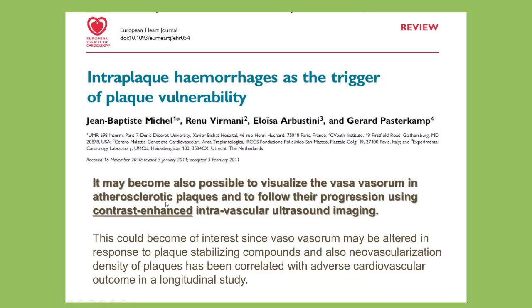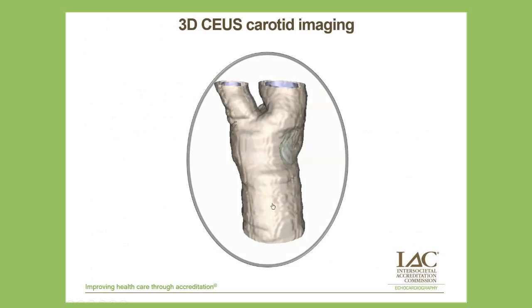And the same authors then went on to say it is possible to visualize vasa vasorum in plaques and to follow their progression with contrast-enhanced imaging. And we do so today.